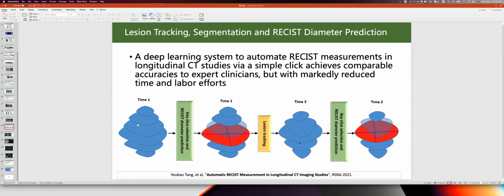Through our experiments, the mean standard deviation of our results is much smaller than that of the human annotations. That means the errors of the automatic results are below the radiologists' inter-observer errors.